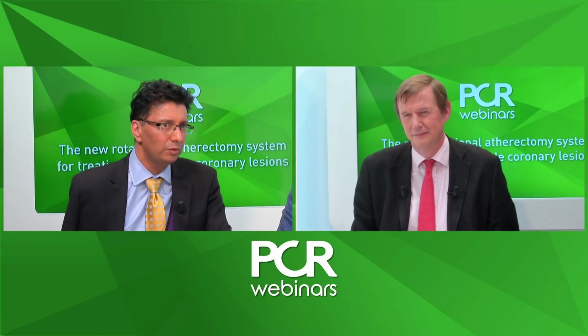Do you have any issues about the length of run, Sagar? No, I'd agree absolutely that usually burr runs of less than 30 seconds are important. And in between each run, you're also giving time for heart rate and blood pressure to recover. It's also important that patient preparation is important. So patients should always be hydrated well through the procedure. And certainly I have a low threshold for using peripheral vasoconstrictors, which don't increase the heart rate like phenylephrine. So short burr runs, and optimize the patient in between as well, and just get a feel for what they're like.